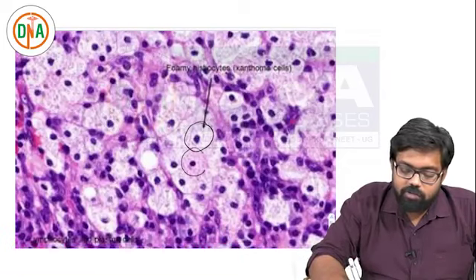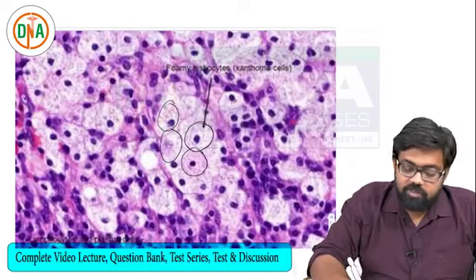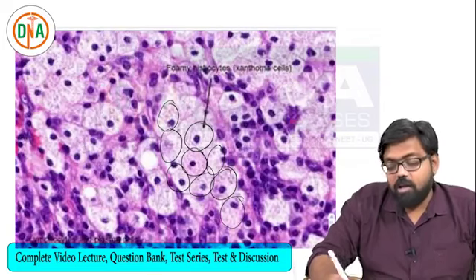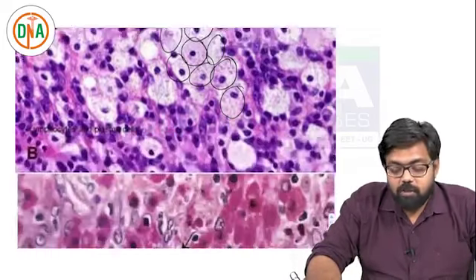Okay, fine. So what is this xanthogranulomatous pyelonephritis showing? It is showing plenty of macrophages which are studded with fat, the xanthoma like cells. These are called xanthoma like cells, seen in microscopy of xanthogranulomatous pyelonephritis.